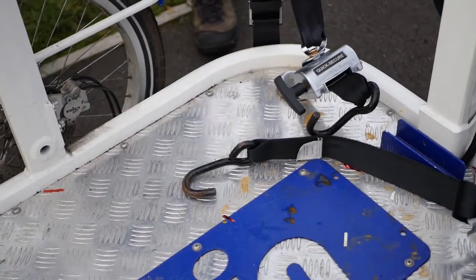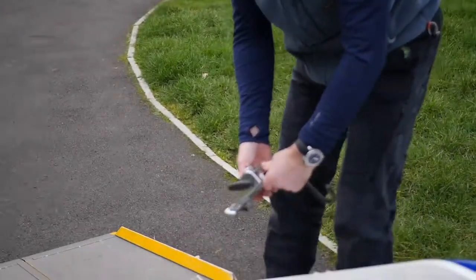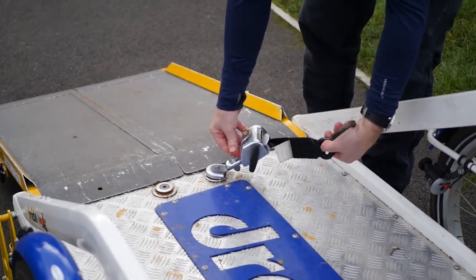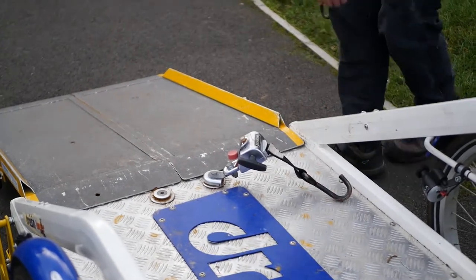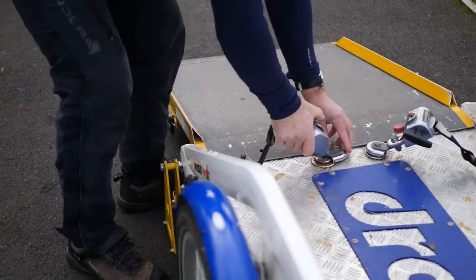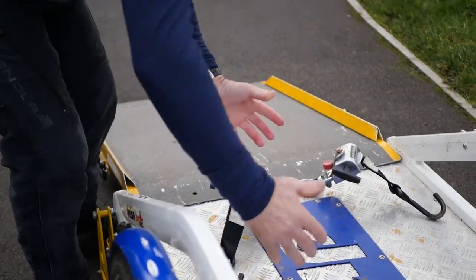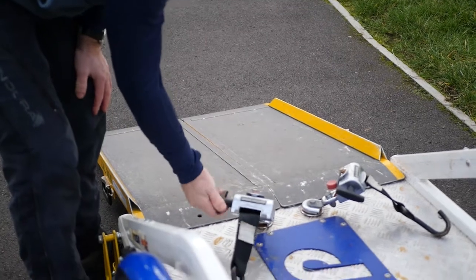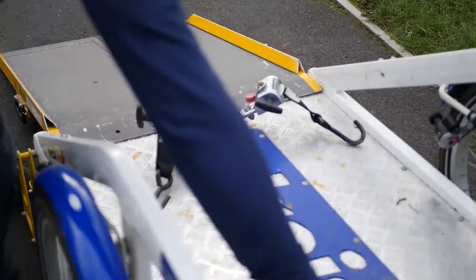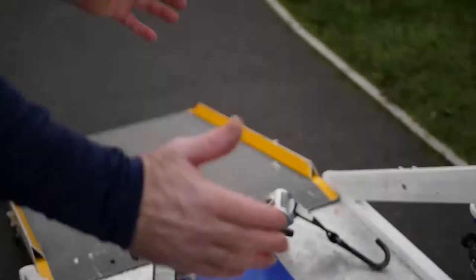Then we come around to the front and find the anchor points at the front left and front right of the wheelchair. Once that's done with loose tension, these winders here wind up the tension to the front, and these tensioners here wind up the tension to the back — so between them the wheelchair is anchored.